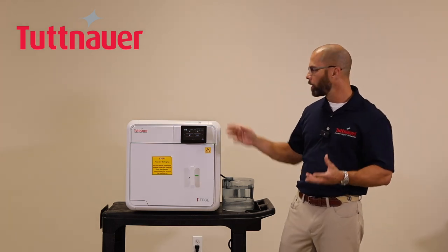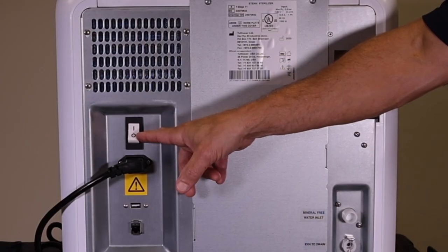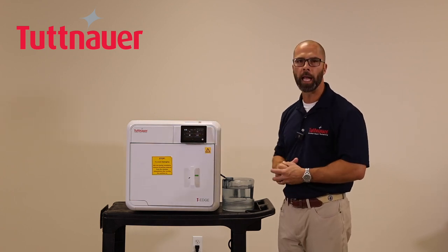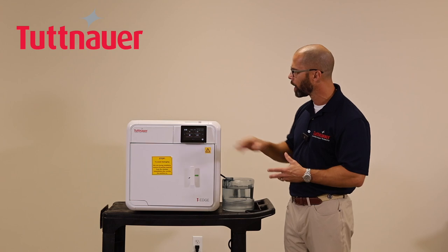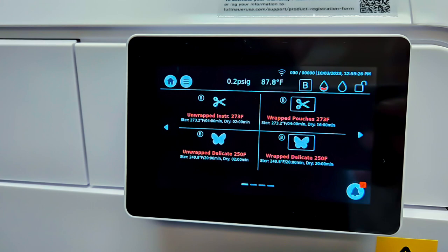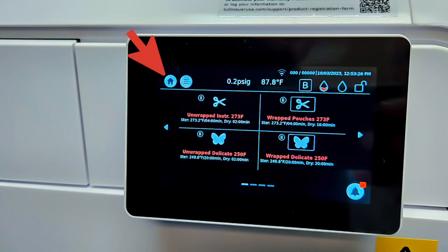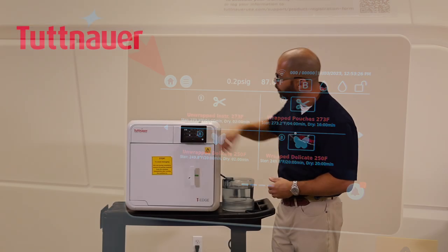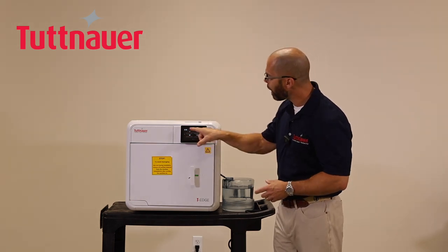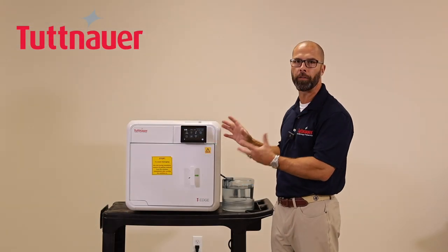You turn the front switch on and off each day while leaving the back main switch always in the on position. On the display you'll see a variety of status information about the machine. At the very top is a Home button that returns you to the home screen from any submenu, and right next to it is a dropdown menu with several useful features and submenus.